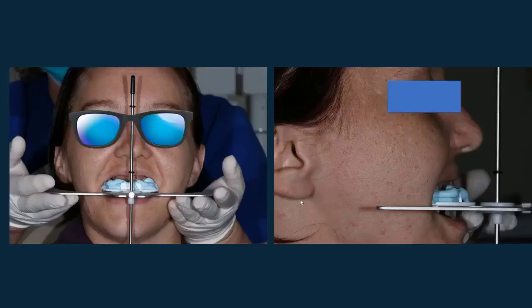All right, I'll take a face bow, which for us, instead of an ear bow, we use that Kois dentofacial analyzer because it'll accomplish the same thing, but more. Okay, so an ear bow is going to put your maxillary cast in the right position relative to the joint, but we don't necessarily gain a lot of aesthetic information. Whereas with this, it also puts it in the right position to the joint, but you've got this, which you align to the midline of the face, this, which you align to the interpupillary line, and then just like a Fox plane, you have this, which aligns to the ala-tragus.